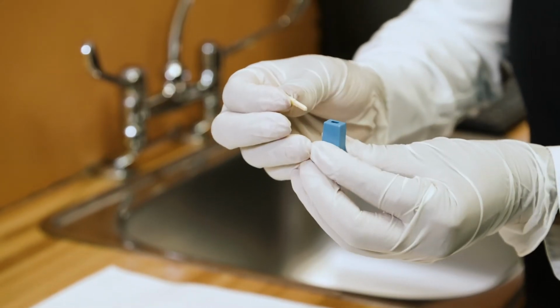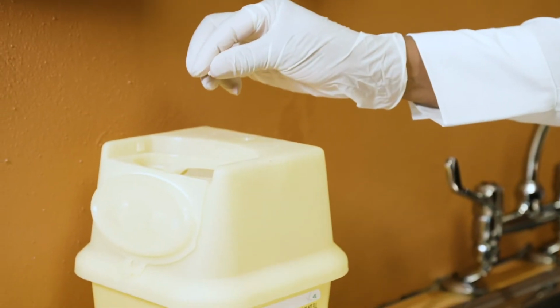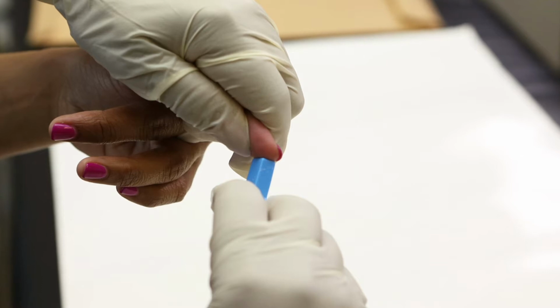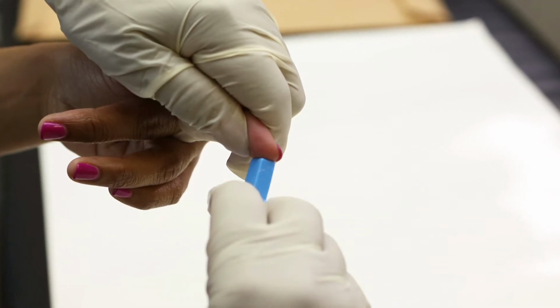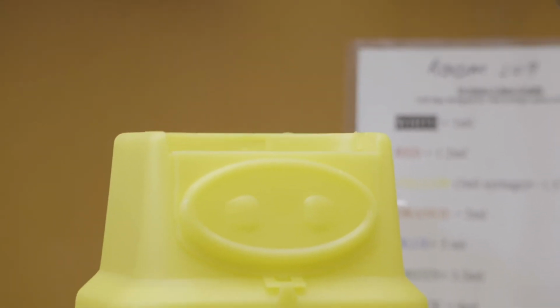Most lancets come with a protective guard that must be removed before the blade can be activated. Once the guard is removed, the lancet should be used immediately. These sterile lancets or glucolets should be used one time only, then properly disposed of in a sharps container.